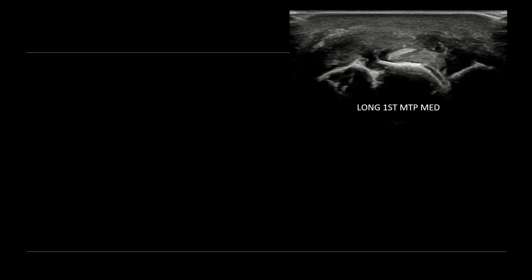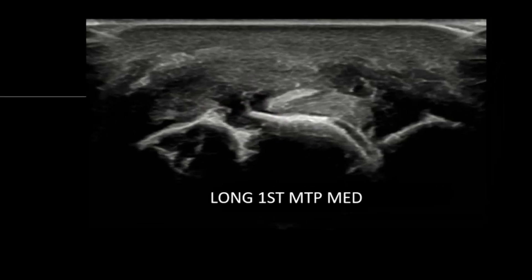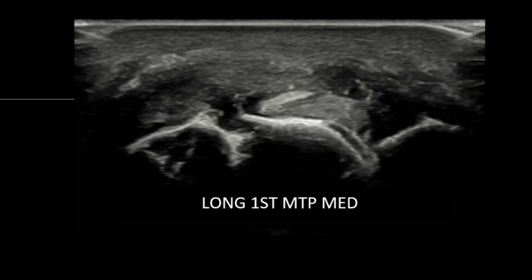There's one last ultrasound finding helpful in the diagnosis of gout. Returning to the initial case of the great toe first metatarsophalangeal joint with the punched out periarticular erosion with overhanging edges and overlying synovial hypertrophy — notice the normal echogenic bony cortex of the metatarsal head, then the anechoic hyaline cartilage overlying it. What's not normal is a second echogenic line on the surface of the cartilage, known as the double contour sign.